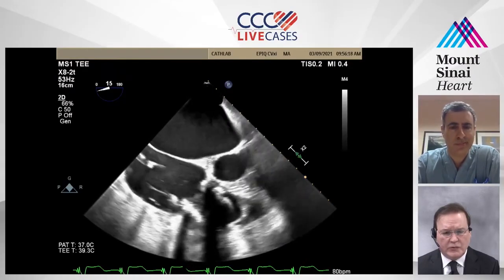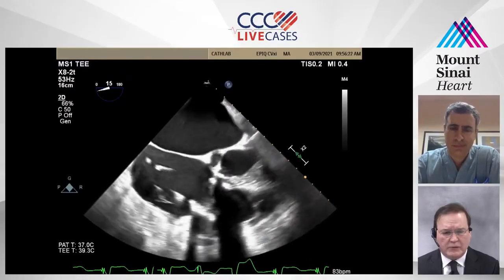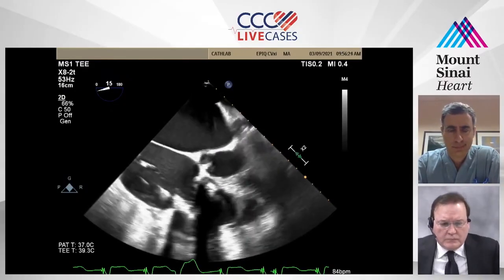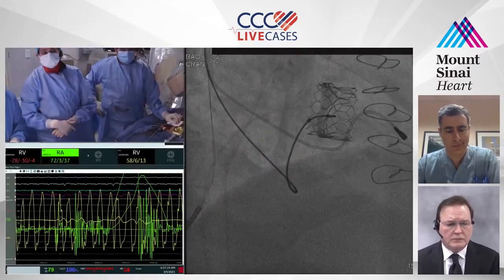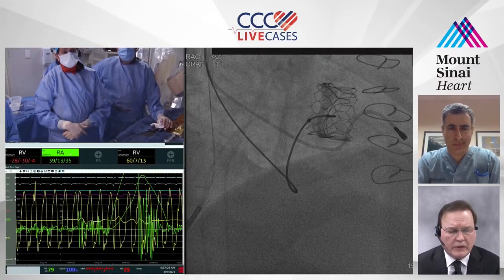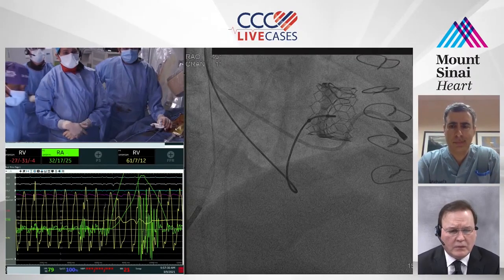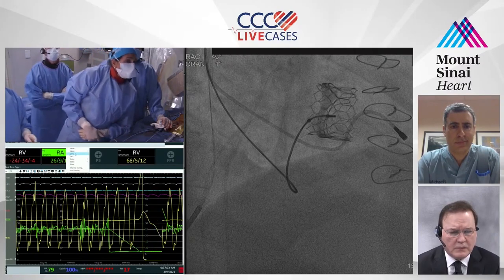Put some blood inside there. Yeah, so there's still about 5 millimeters. Okay, show the hemodynamics, please. Can you do nitro? Re-zero the green color? Systemic pressure is good, it says? Yeah, systemic is 110. What about some nitro now?